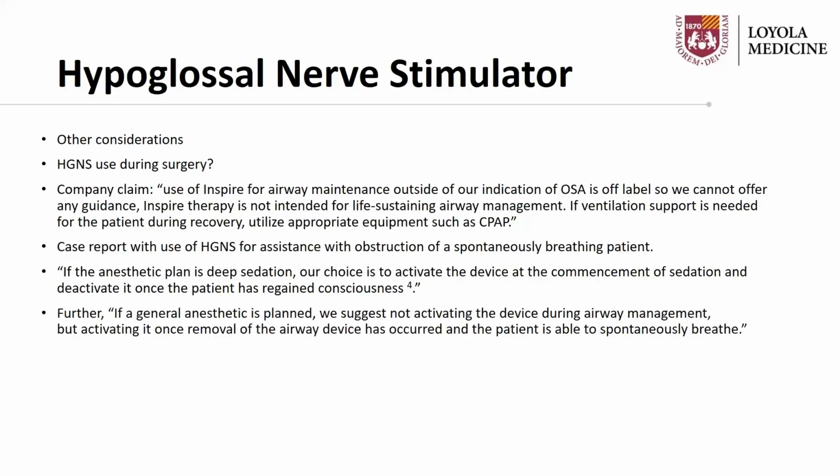Further, if a general anesthetic is planned, they suggest not activating the device during airway management, but reactivating again once removal of the airway has occurred and the patient is able to breathe spontaneously. In other words, as long as the patient is breathing spontaneously, this group favored this device usage under certain conditions to assist with obstructive breathing, which I think is an interesting point.